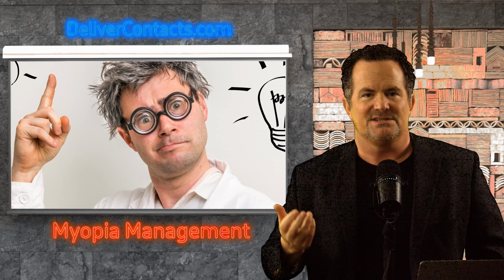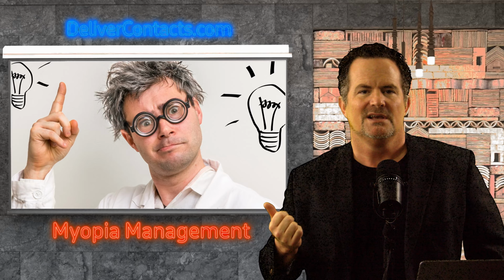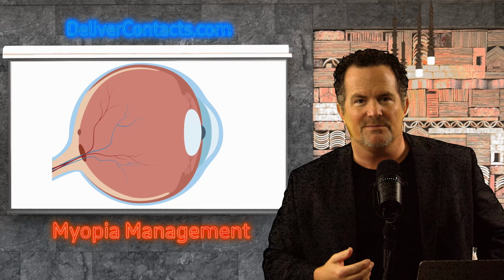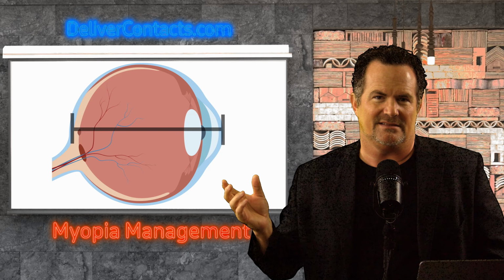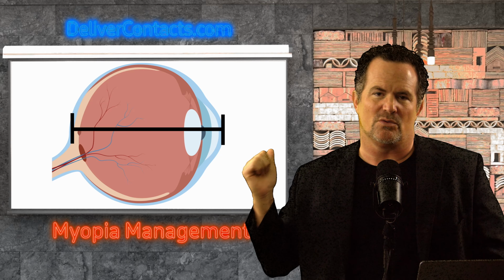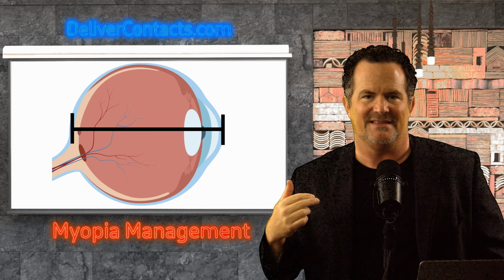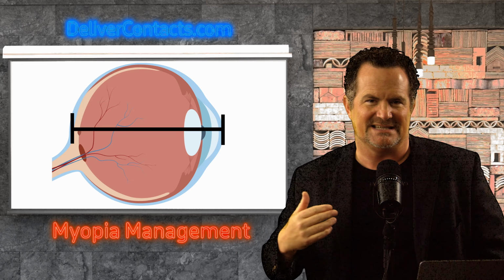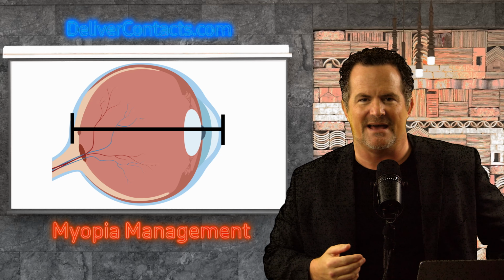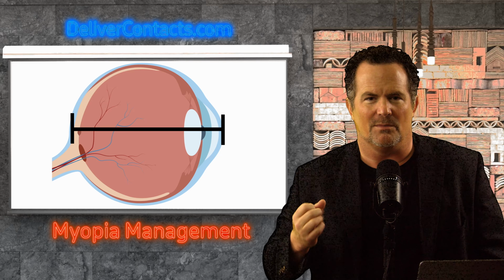Well, again, the astute doctors that were doing these fits were like, hey, how come our kids' myopia is not getting worse? So apparently there's an association there, and it's associated with the axial length. It's kind of hard because, like I said, we measure the axial length in hundredths of millimeters, and when you distort that cornea, you're changing the axial length, because the axial length starts with this front cornea, and you're flattening that cornea. And there's a warpage effect that takes time to resettle. So it makes it very hard to check to see if that axial length is affected as much with that Ortho-k procedure.